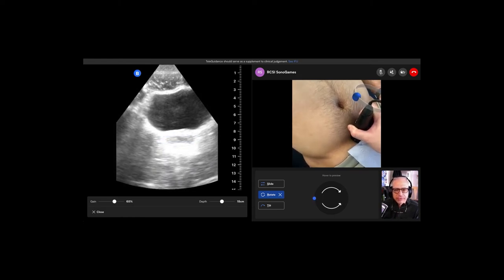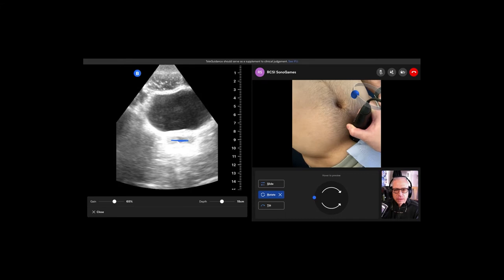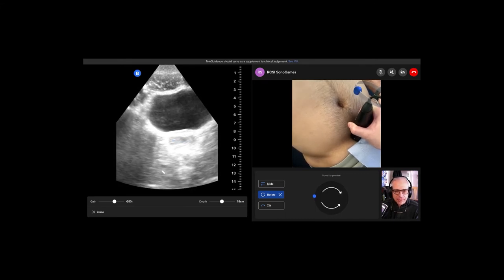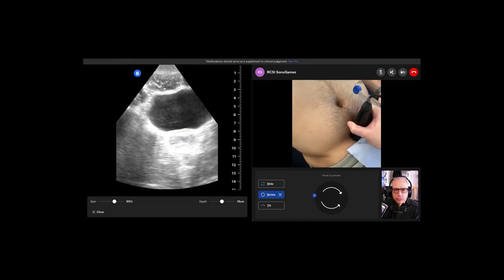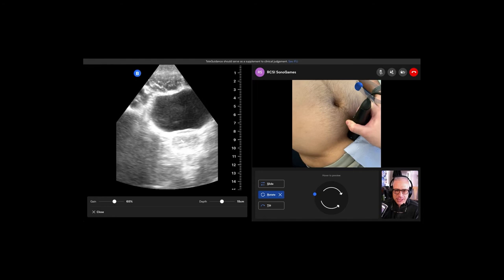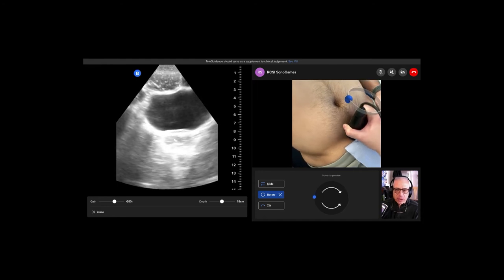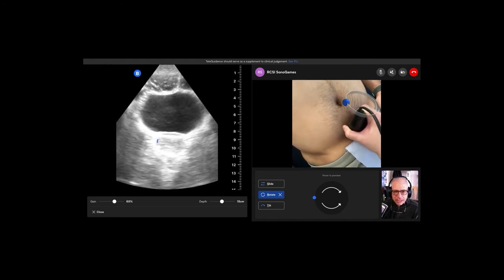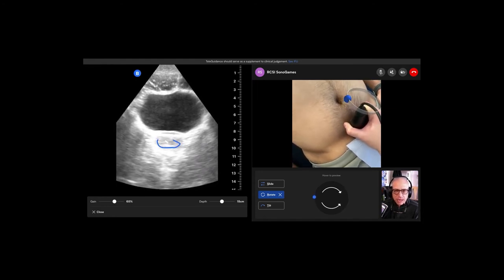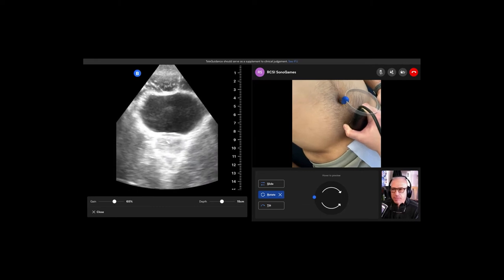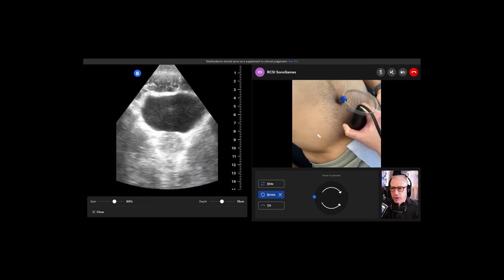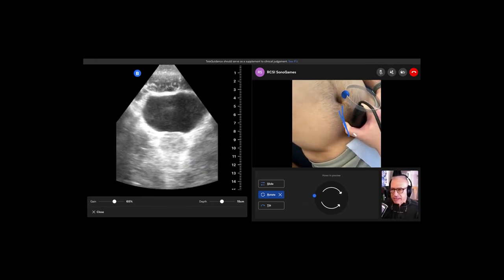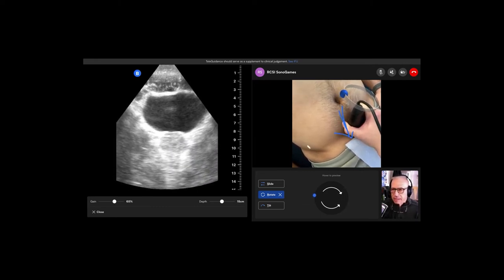That's seminal vesicle. Absolutely. So really important to remember that in men, you will see this area of hypoechoic area. It's well circumscribed, but that gets called as a false positive all the time. Also, you see how your hand is kind of at a diagonal? Yeah. Right?